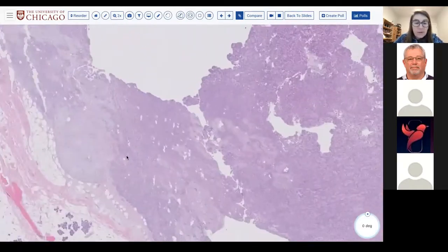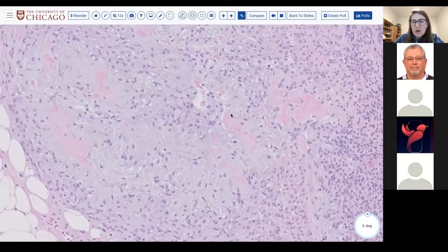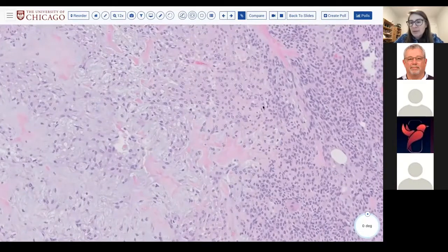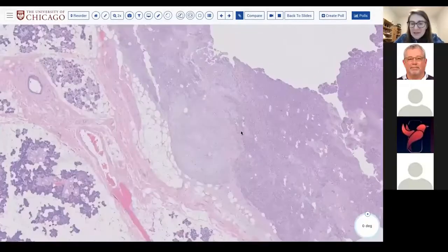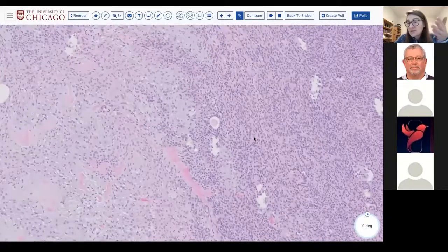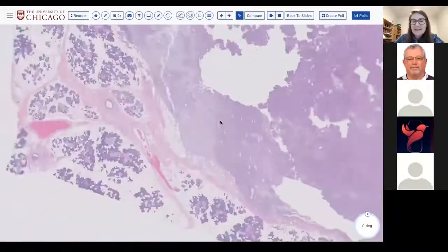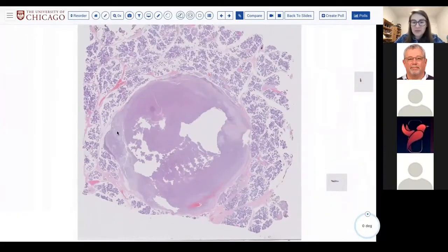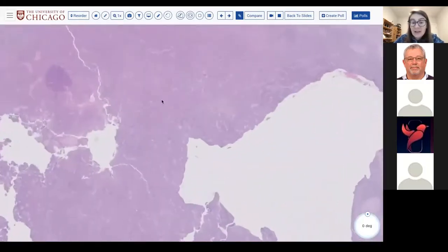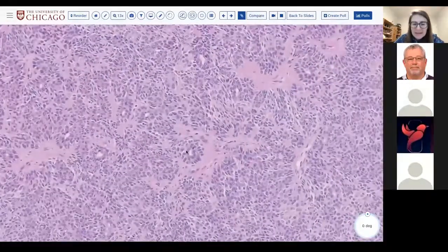And so focally, only very, very focally, is that characteristic myxoid, myxochondroid stroma with some perhaps hyaline plasmacytoid myoepithelial cells that may make you think of, yes, pleomorphic adenoma, all right? In this case, the core biopsy got mostly the cellular area, but did catch some of these ducts. We can say it's biphasic, we can say it's low grade, and then when the resection comes out, it appears quite circumscribed, with very focal myxoid areas, but overall very cellular, quote unquote, cellular pleomorphic adenoma. And now you can perhaps maintain these ducts here.